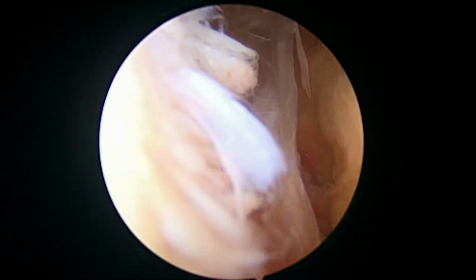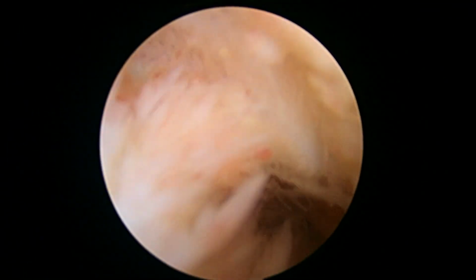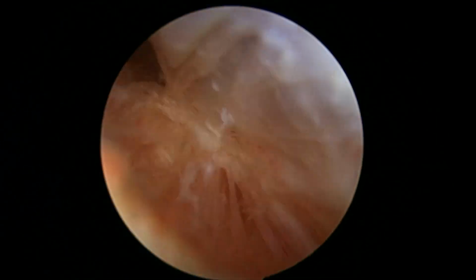Okay, so now we're going to look up here. We'll look down this lateral gutter. Nothing loose down there.